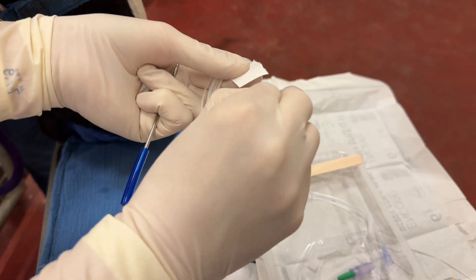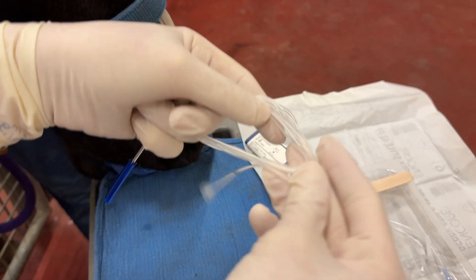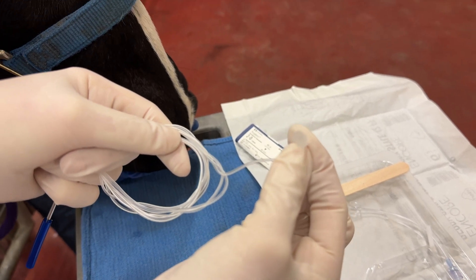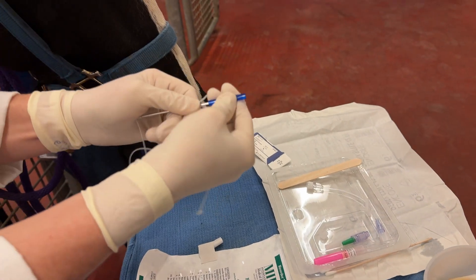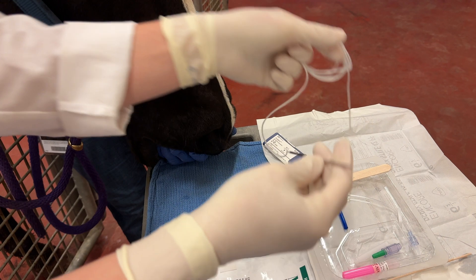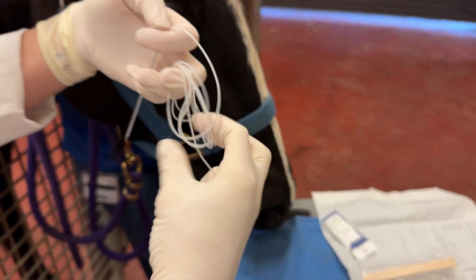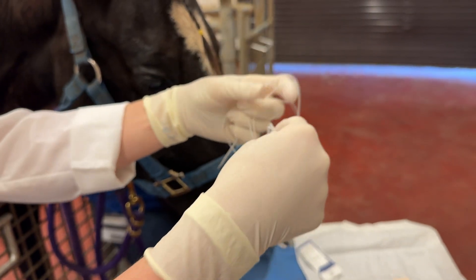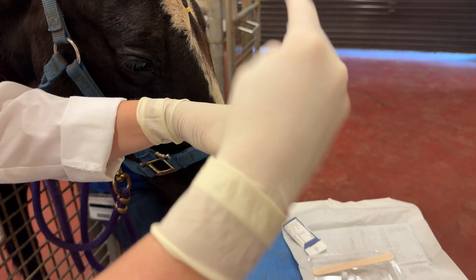We use the Myla eye lavage kit. The foot plate keeps the lavage line within the eyelid so that it can't be dislodged. This is the trocar that's going to drive the line through the eyelid and keep that foot plate firmly secured down in the conjunctival fornix. I wrap the whole line around my hand in order to keep it out of the way so that it doesn't drag on the horse's face and become contaminated. This is considered a clean but not completely sterile process.